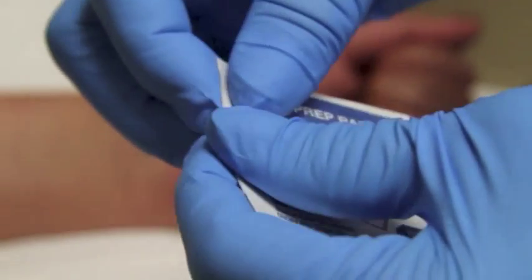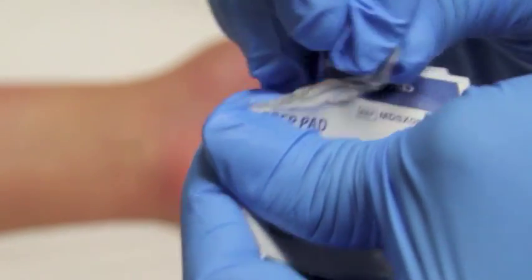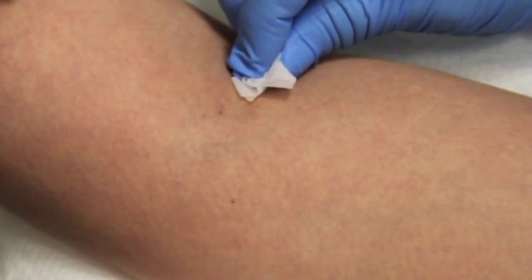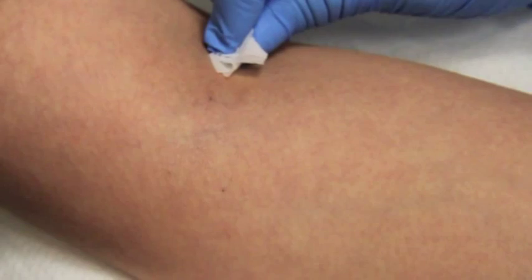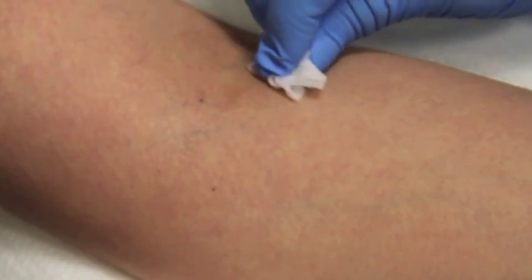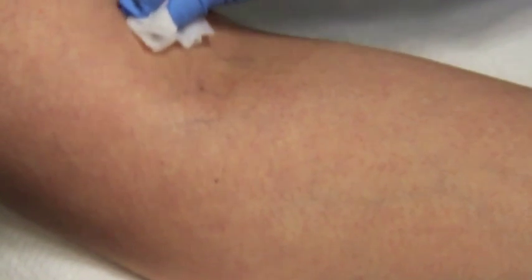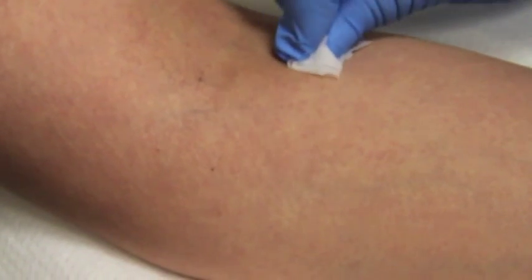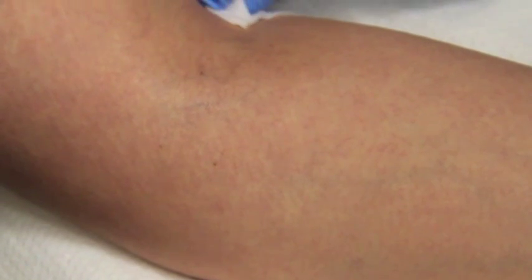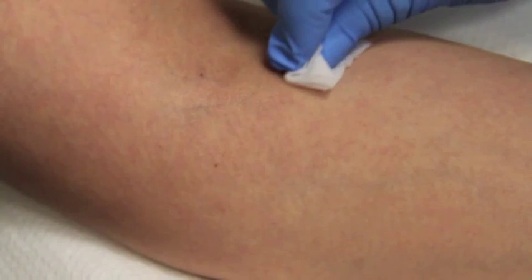The disinfecting process is performed by using the alcohol swab in a circular motion from the inside outwards in the selected area. Care should be taken not to touch the disinfected area again. If necessary to retouch this area, swab again. Allow the area to dry well before introducing the needle.